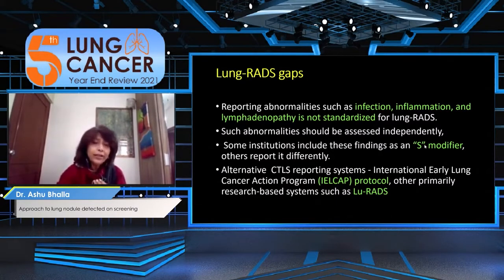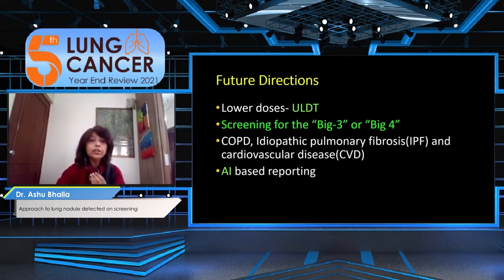And while there is a guideline on the S modifier, it's not very clear. And different institutions report it differently. Are there any other CT reporting systems for LCS? There are, and different countries may follow it, but the most prevalently followed is Lung-RADS, and in the US, at least that is the only one which is authorized by insurance, so that's why that's picked up the most.